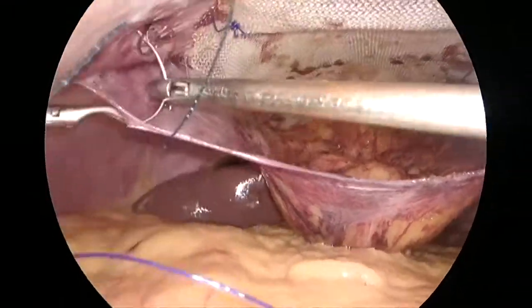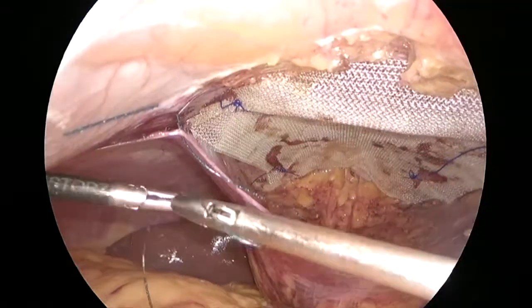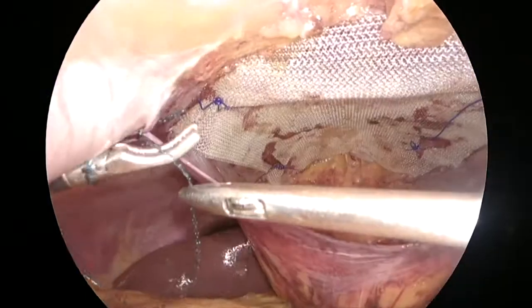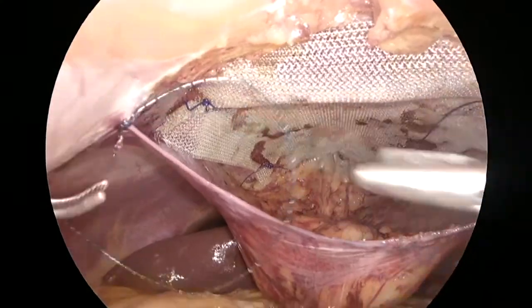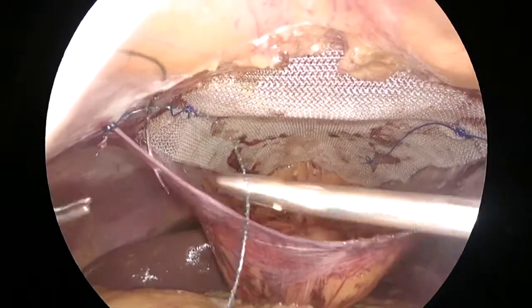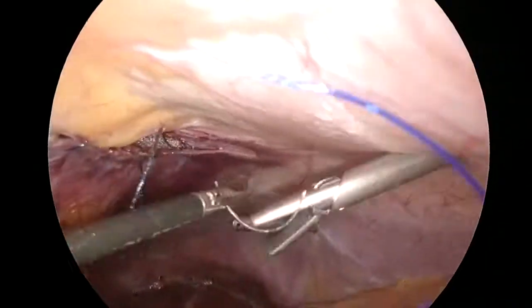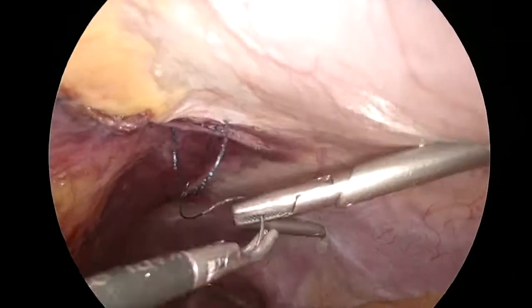Finally, we re-approximate the peritoneum. The mesh was fixed at multiple places, and finally the peritoneum is re-approximated with a 2-0 V-lock suture. Thank you.